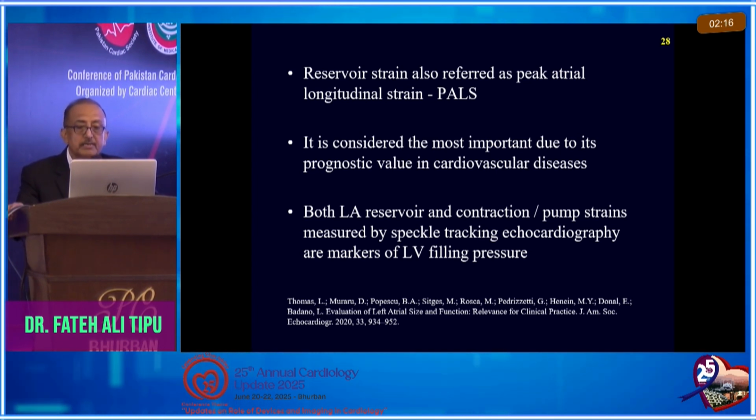Both LA reservoir and contraction or pump strains measured by speckle tracking echocardiography are markers of LV filling pressures, and they have good correlation with the diastolic function.